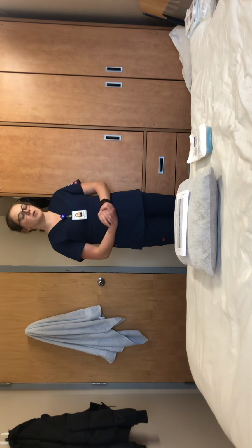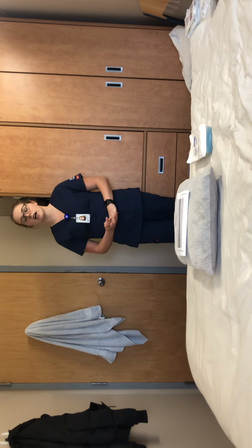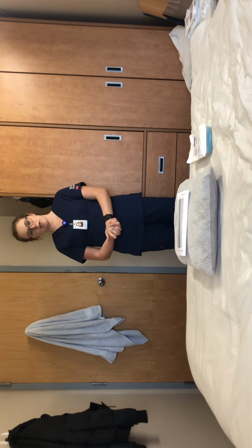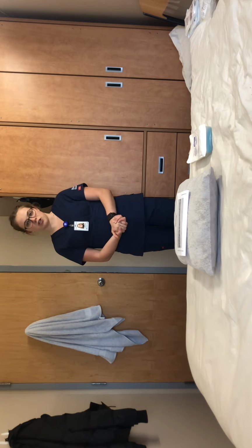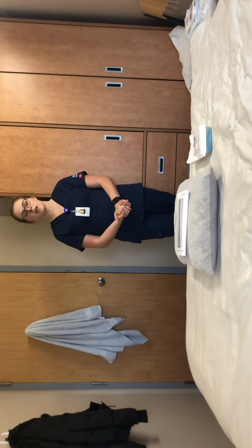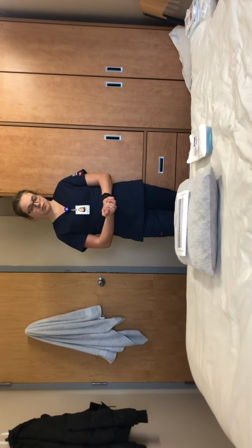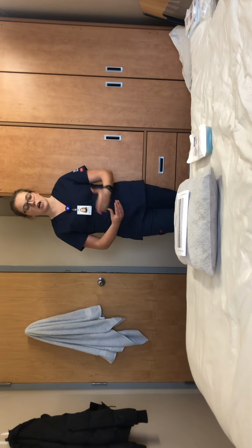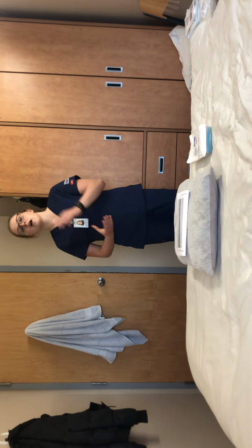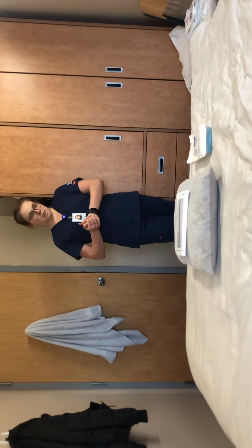Once I enter the room, I'm going to introduce myself, what I'm doing here, obtain 2 patient identifiers, and also ask the patient how they would like to be addressed. So, hello, my name is Cunningham, and I'm a first year nursing student with the University of Windsor, and today I'm just going to be doing a dressing change for you. Could I please get your first and last name and date of birth? And once they give me that information, I'm going to check with either their hospital wristband or on the patient chart they have given me. And then I would also ask them, how would you like to be addressed today?